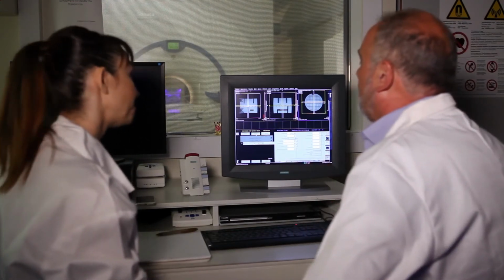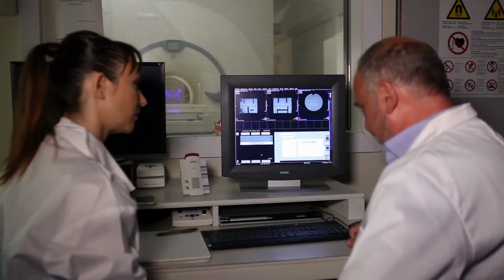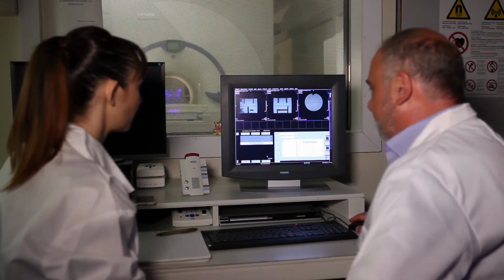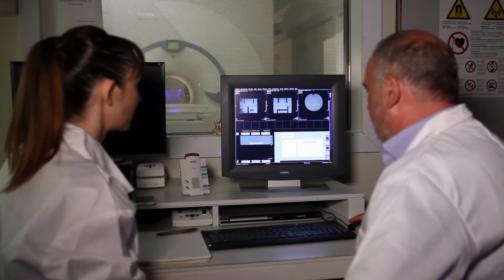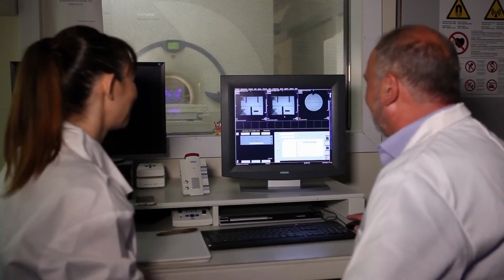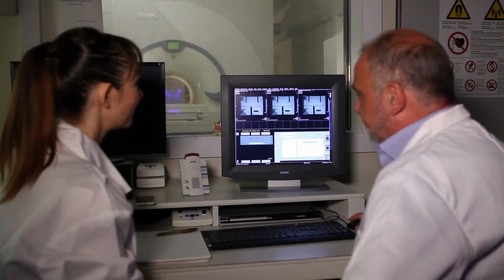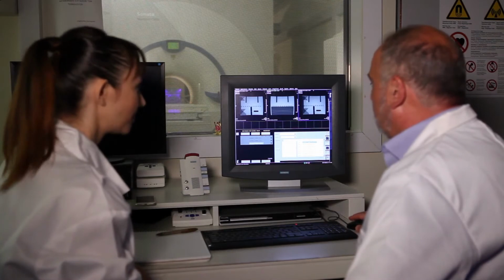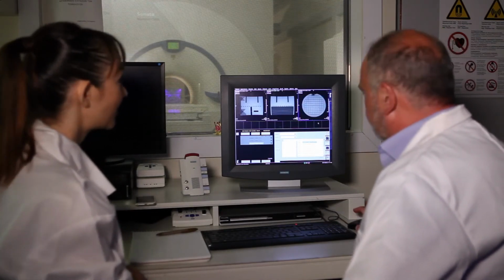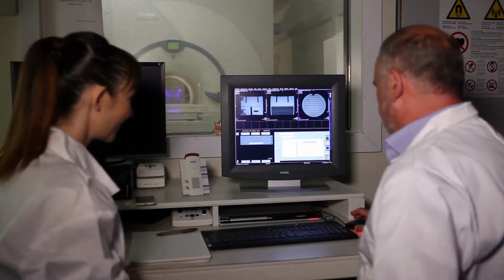Okay? Apply. What you're going to see now is everything shifted to the center of the scans, at the center of your windows. That's the idea. Okay? There it is. Again, we're dealing with the sagittal slice, then we have the coronal in the middle, and at the right side we have the axial. And everything is in the middle. So this is our phantom, and this is exactly where we're ready to start doing the measurements.